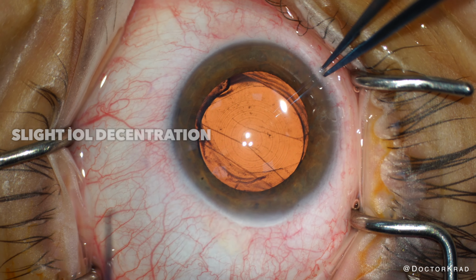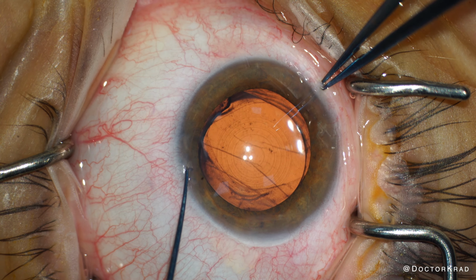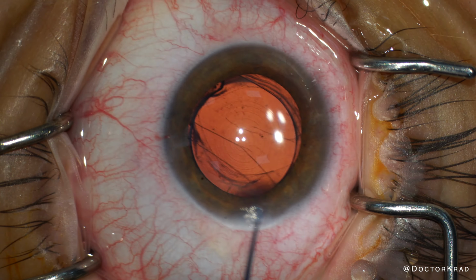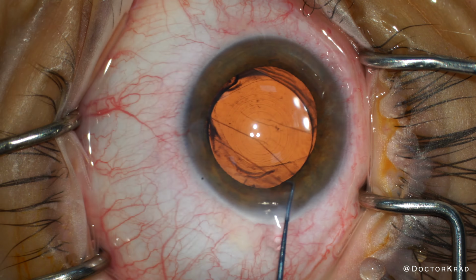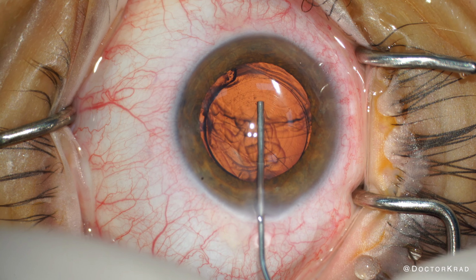Here we are at the start of the case, and look at that capsular contraction, so many wrinkles and folds. The lens is slightly decentered temporarily, but not horrible. And I'm opening up the previous incisions using a Sinsky hook. I can understand why the primary surgeon wanted to put a CTR, hoping to keep that capsule expanded and on stretch.